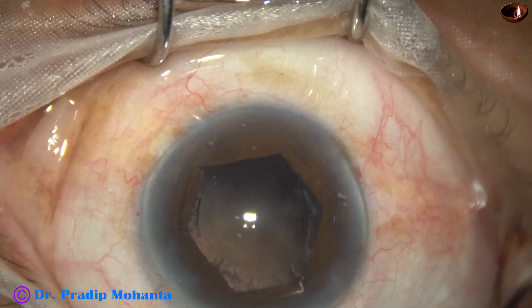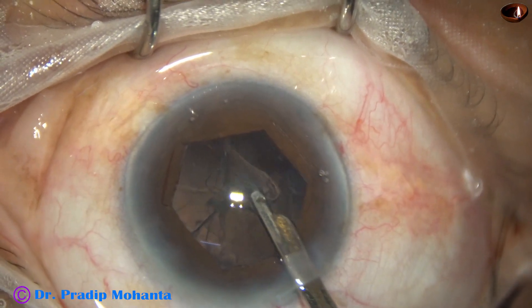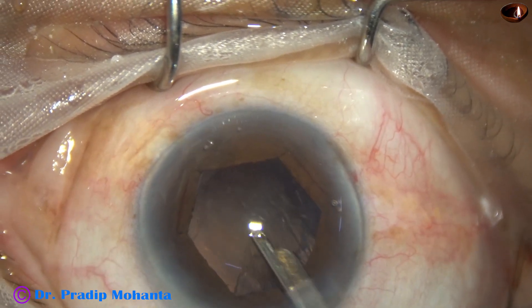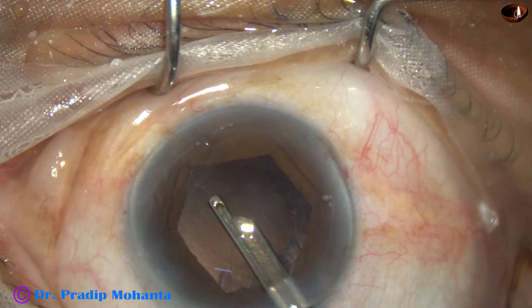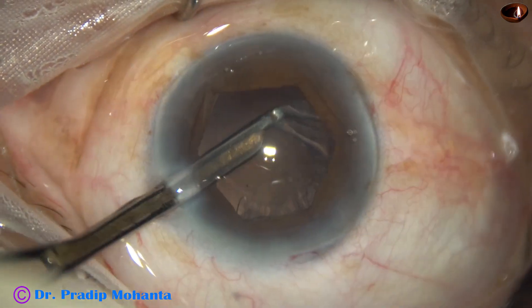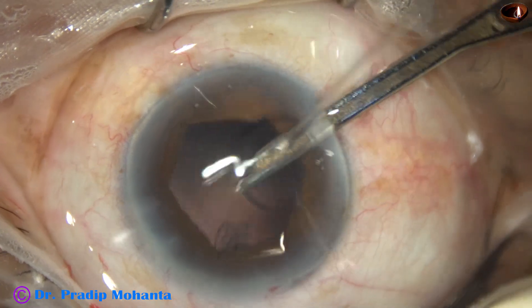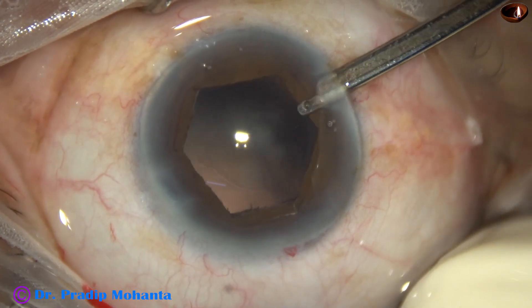Viscoelastic — 2% hydroxypropyl methyl cellulose — is injected. I go into the anterior chamber with a 23-gauge Simcoe cannula to remove the cortex. When the zonule is weak, the cortex appears firmly attached to the capsule — the capsulo-cortical adhesions are strong — and we have to be careful in such cases. We must hold only the cortical matter and gently pull it. If we hold the capsule and pull it, there will be zonular dialysis immediately because the zonule is already weak.